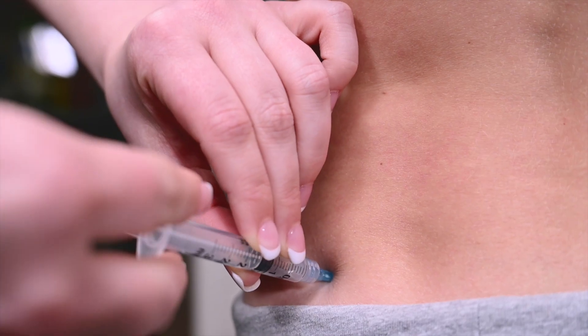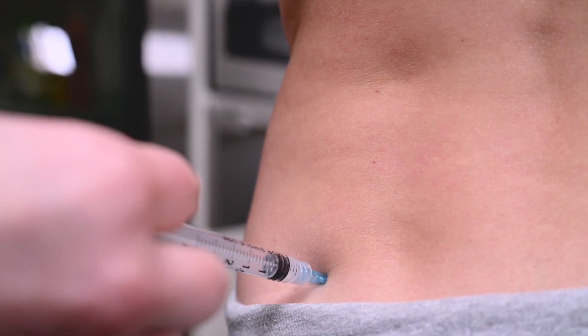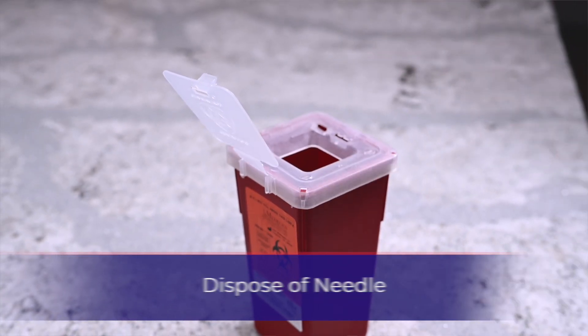If blood does enter the syringe, remove the needle and reinsert in a nearby cleaned injection site. Push the plunger until all the medication transfers into the injection site. Gently remove the needle and apply pressure with the gauze. Dispose of the used needle into the designated sharps container.